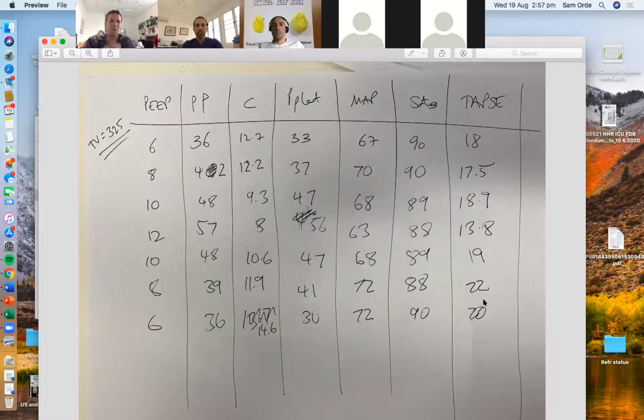And the TAPSE improved. I was maybe using this as an example that maybe there was some lung that was a little bit recruitable, but obviously I wasn't going to do a standard recruitment maneuver where I normally go up to PEEPs of 30 or even sometimes 40. But it told me that the optimal PEEP, which the other specialist I'm working with had just set without doing this, was exactly the right one.